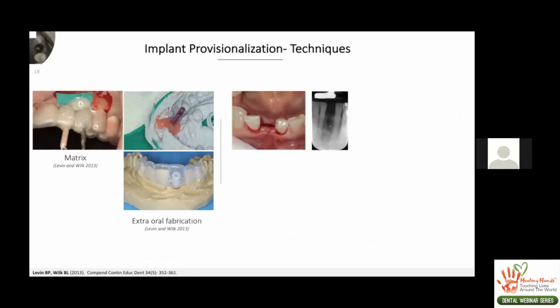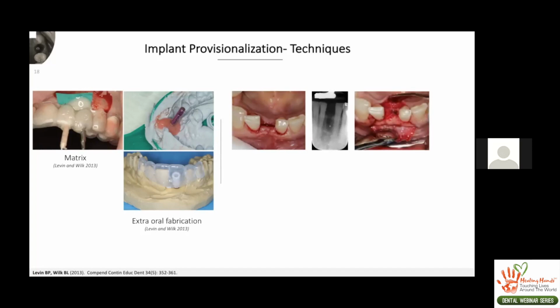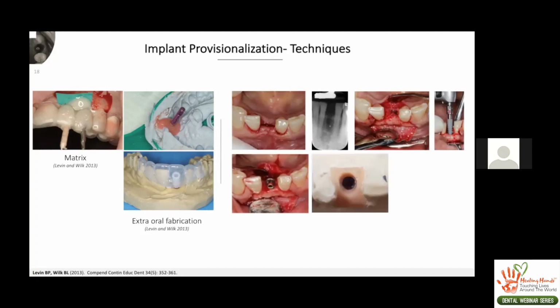This is a patient who had a mandibular anterior tooth missing, number 25. There were still residual root segments and granulation tissue in the extraction socket, which didn't quite heal very well. So when I opened this mucoperiosteal flap, the osteotomy was sort of already there for me. I did not have a lot of room to decide where to place that implant, but thankfully it was at a very desirable position. You can see it's just a little bit more lingual, which is where I would want the axis of the implant to come out through. So this is the implant placement that has been done.